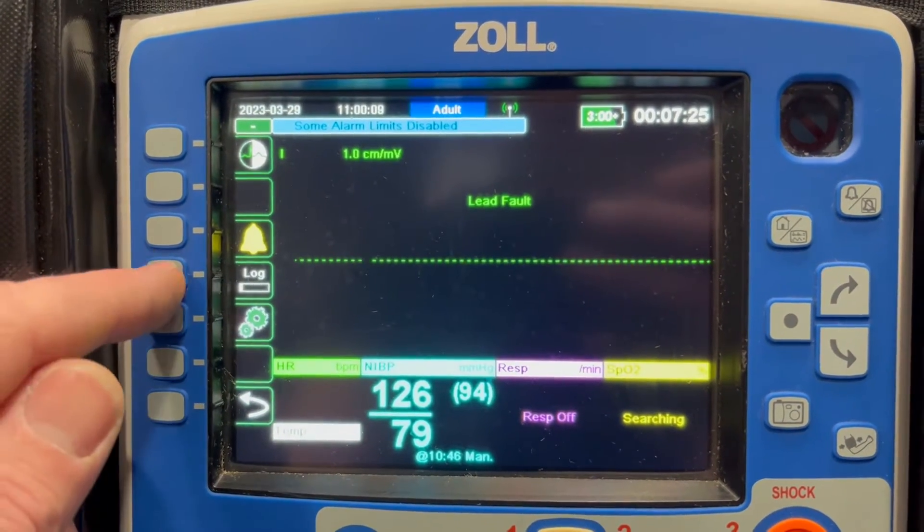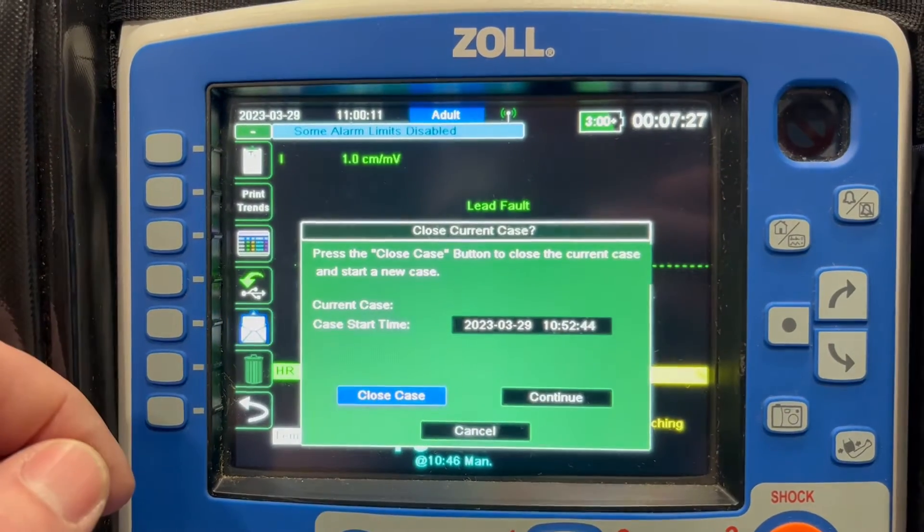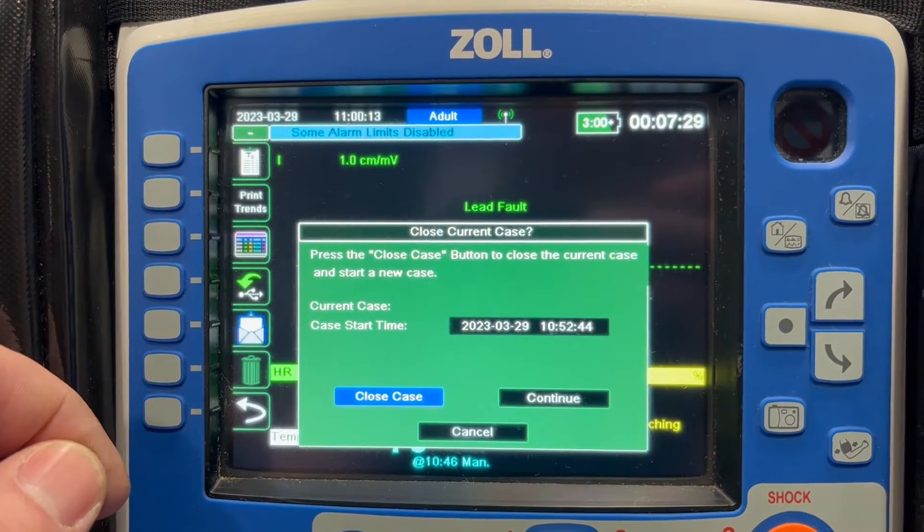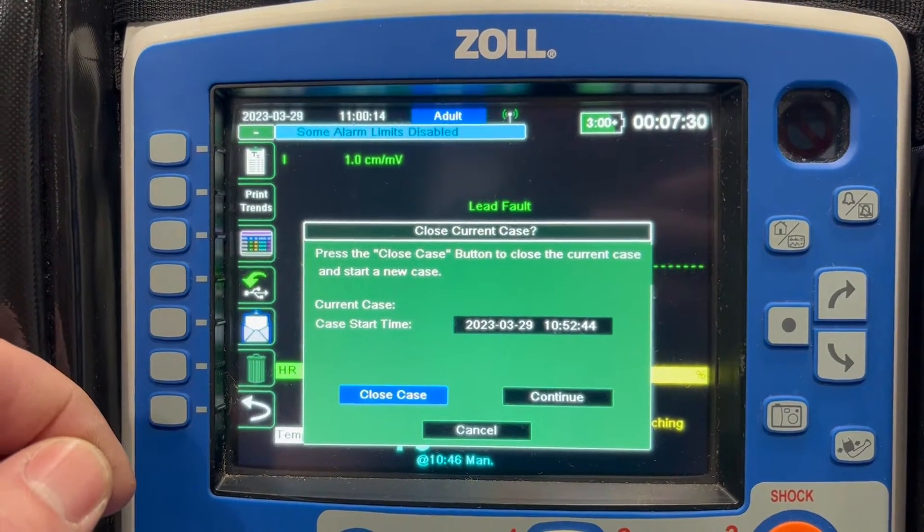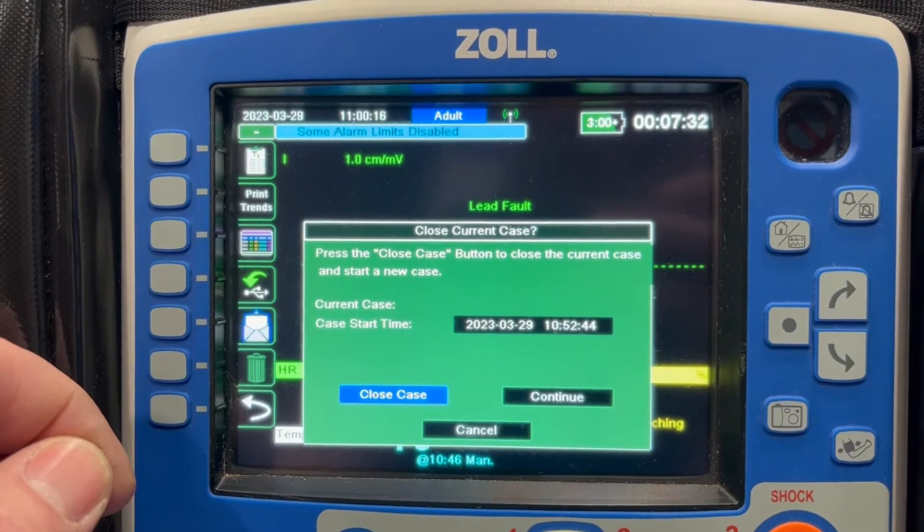So second page of options, you go under log. There's a white envelope right here. It's going to ask you if you want to close the case or continue. That's going to be dictated by when you're doing this.